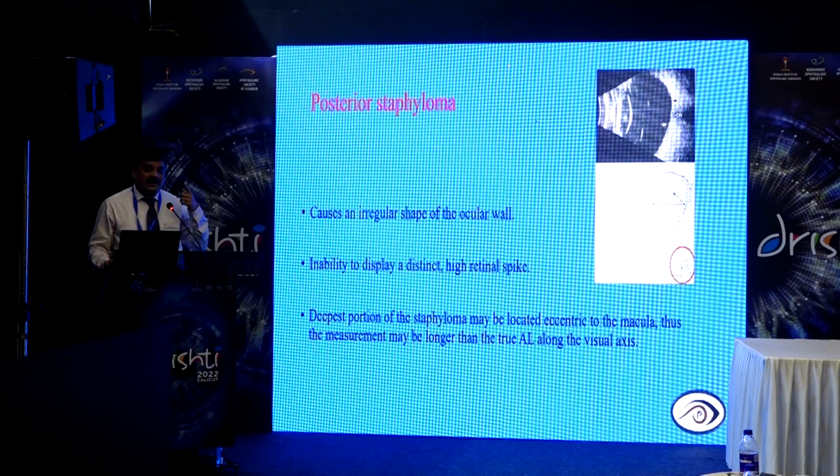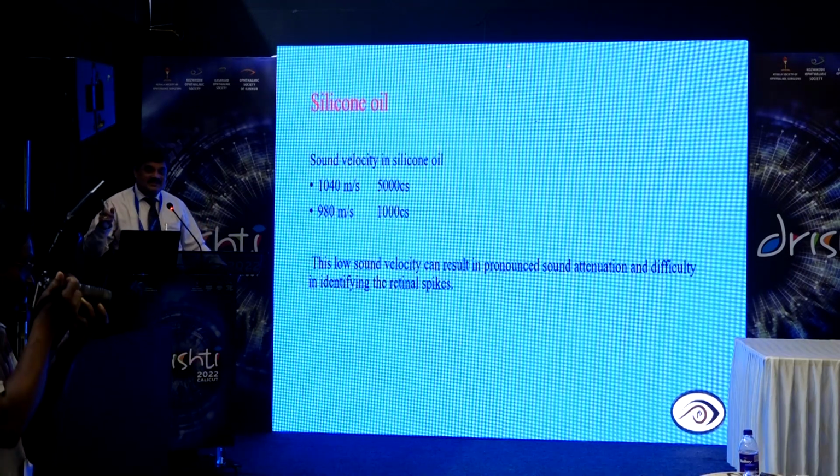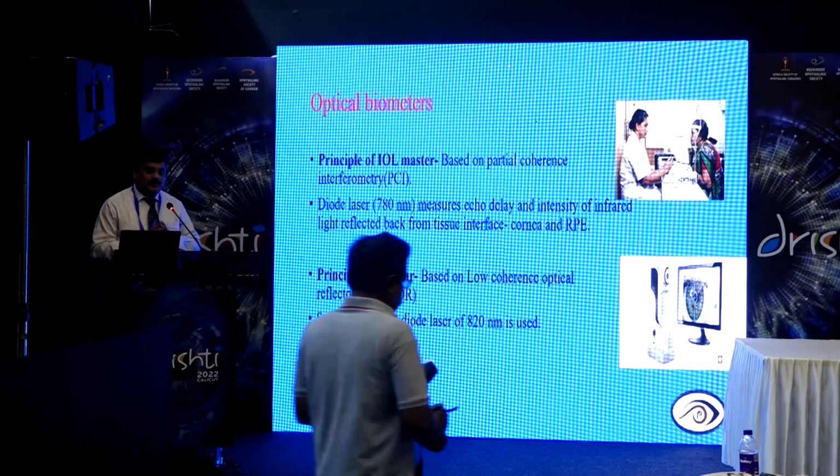I do remember I did a scan with a posterior staphyloma. In spite of optical biometry, I had to reoperate 2 times. So as I said, with silicone oil, you have to decrease the gain. So let me come to the optical biometer.